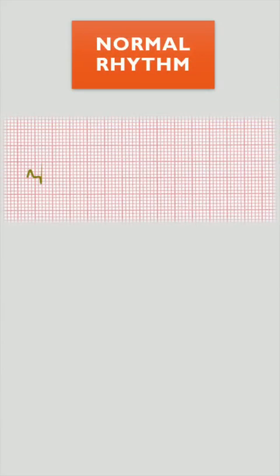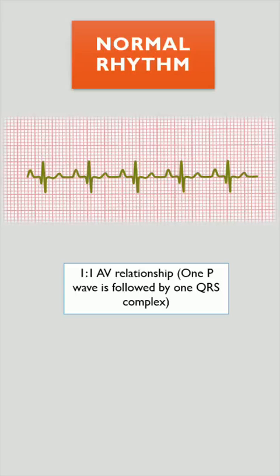This is the ECG of a patient with normal sinus rhythm. Try to identify P waves and QRS complexes. Each P wave is followed by one QRS complex. So 1-to-1 AV relationship is maintained, which happens in normal sinus rhythm.